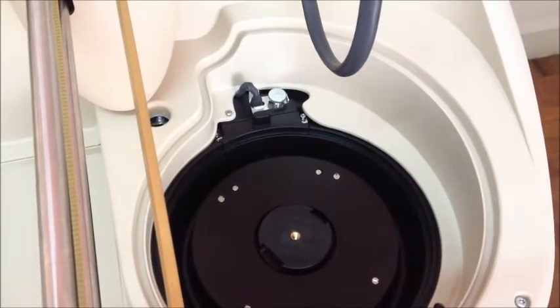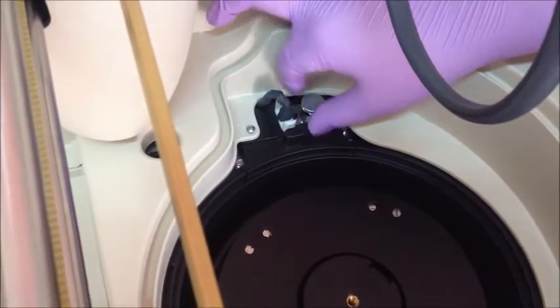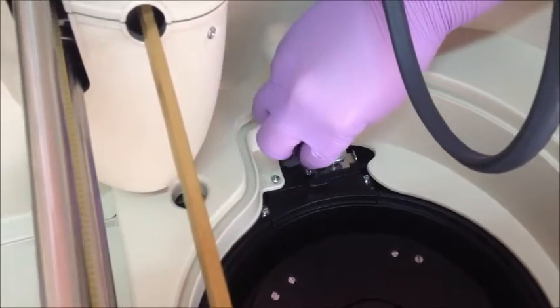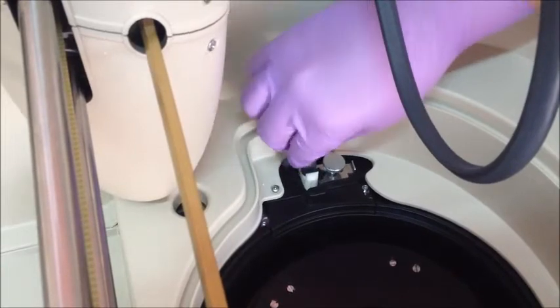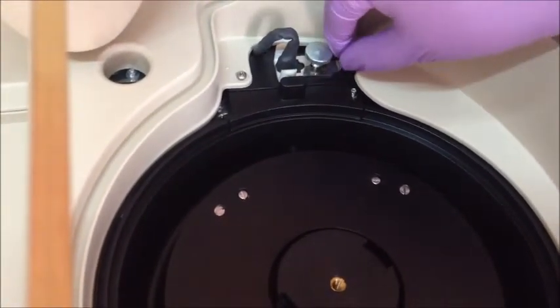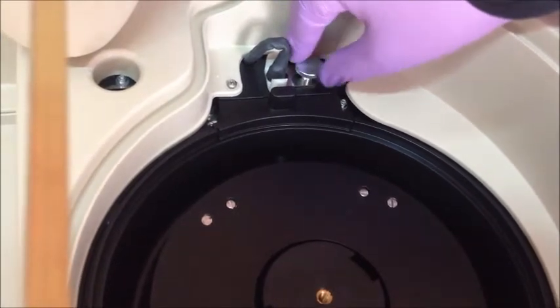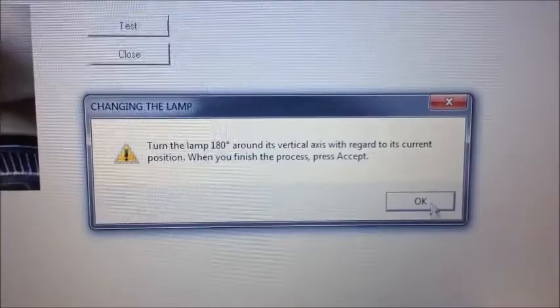Remove the rotor cover, then loosen the thumb screw and unlock the metallic plate holder. Turn the lamp around and put it back on its socket. Tighten the thumb screw, put the rotor cover back, and click OK on the user software.